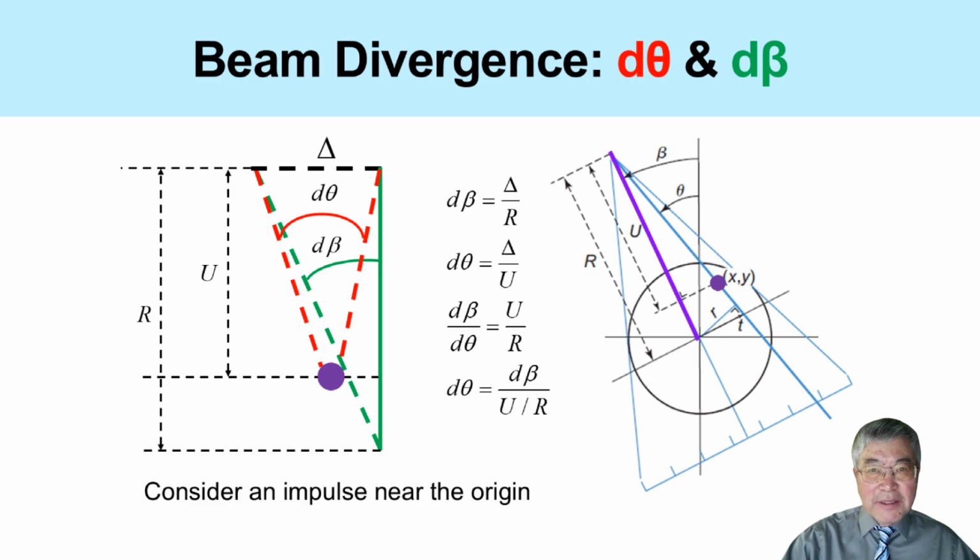But we still need to be careful. These two effects explain why the geometric ratio appears, but they do not yet fully explain how the factors combine in the final filtered back projection formula. So we need one more step. We need to look at what happens when the magnified projection is passed through the ramp filter.